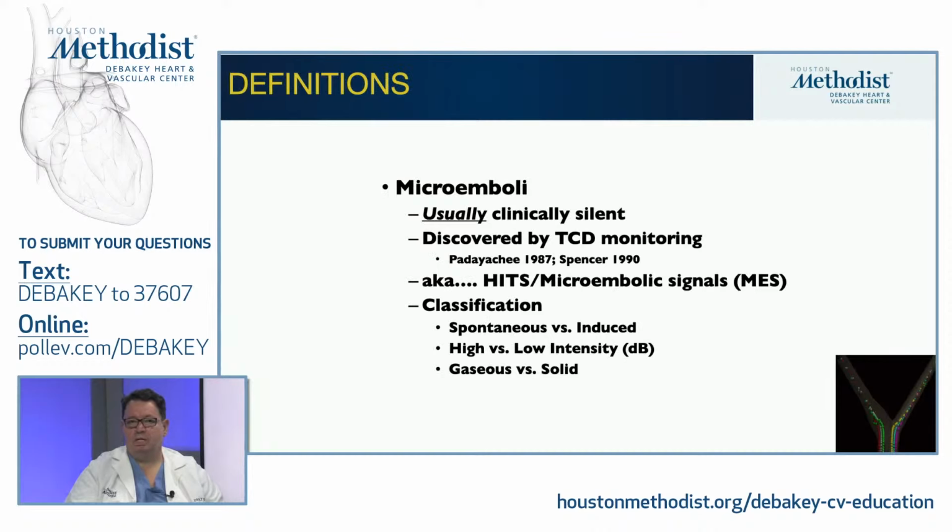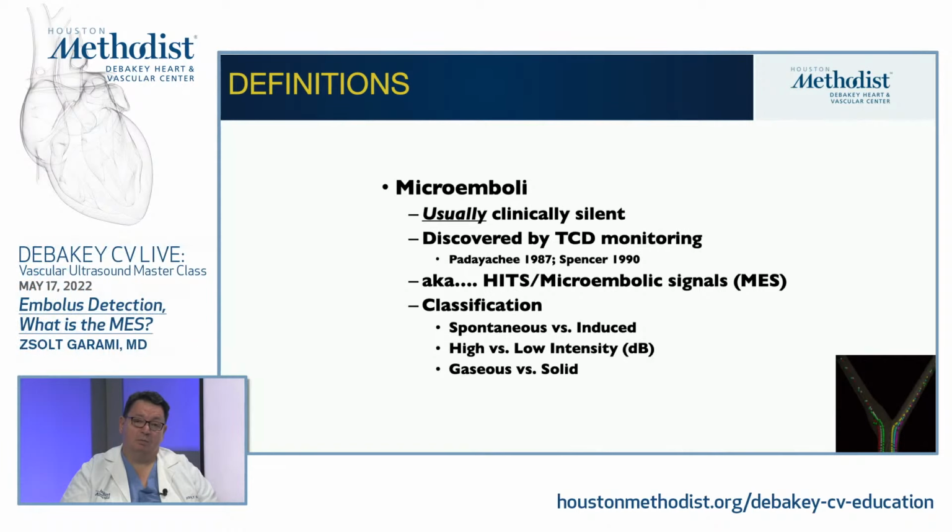So what you see as a definition, a microembolus signal was classified and introduced as a spontaneous and random reappearing signal. And what we think is, at the moment, we just cannot truly differentiate between gaseous and solid particles.